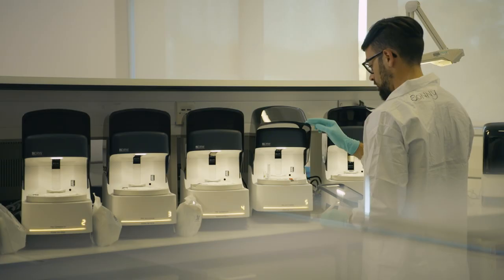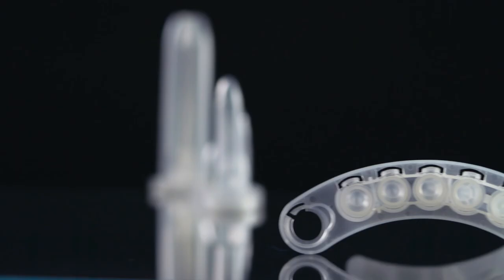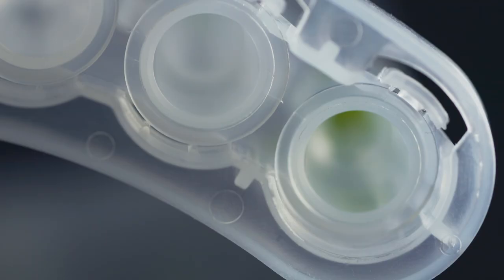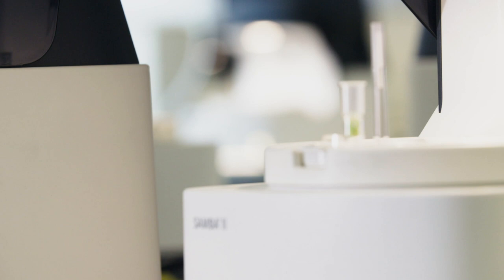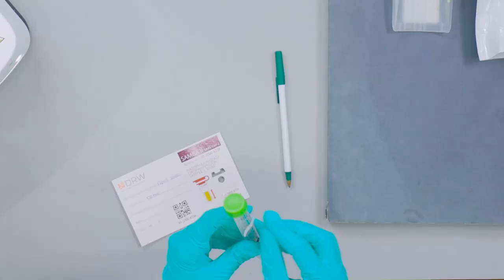Unlike many diagnostic methods, the SAMBA 2's chemistry does not generate poisonous cyanide, which makes other devices difficult to use. The SAMBA 2 machine is very simple to operate, small — the size of a coffee machine — and can be operated anywhere by anyone. It's also very safe because the buffer in which we put the swab kills the virus very quickly, so you do not need a laboratory or a biosafety hood to work on the sample. The buffer that inactivates the virus, making it safe for use anywhere, is the subject of a patent application.